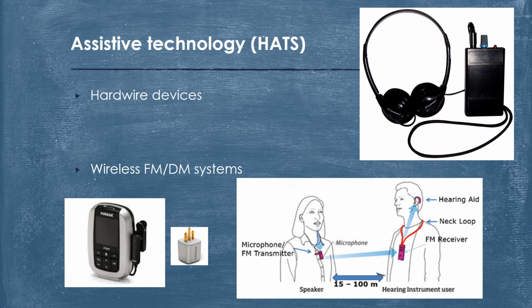So in skilled nursing facilities, those are a really good option. Or if you have a patient that comes in and they're so hard of hearing that you can't even have a basic conversation, you could easily pull one of these out of the drawer and talk to a patient.